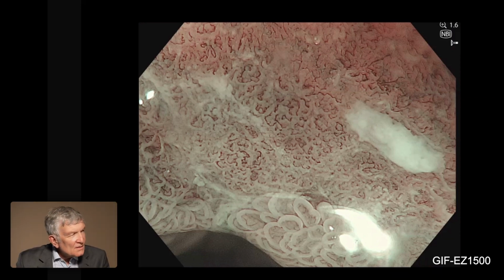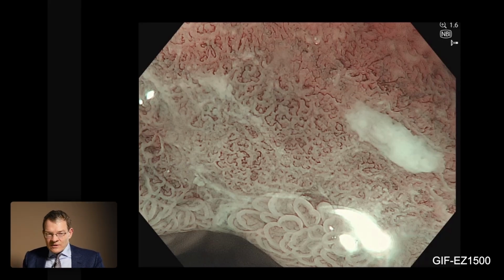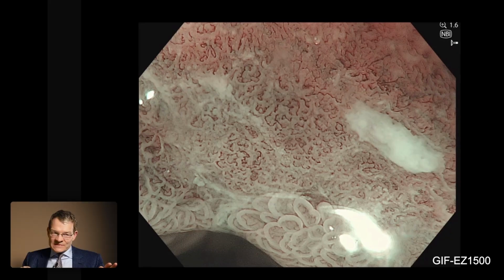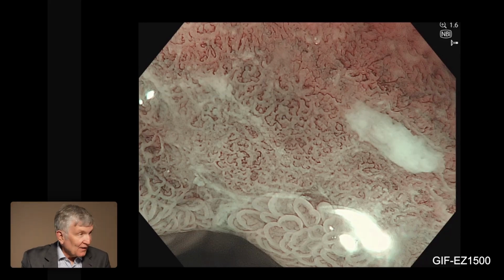So the issue is inflammation all over the place, and then you have some malignant cells, but you can't precisely predict what is what. Exactly. The mix-up with inflammation and early cancer is very complicated. But definitely there's something wrong here, if you see that. Yes, definitely. But I have to admit, sometimes you would not detect this without using a cap at the endoscope. Yeah, I'm also a big cap fan. I'm an imaging skeptic, but I'm a big cap fan.